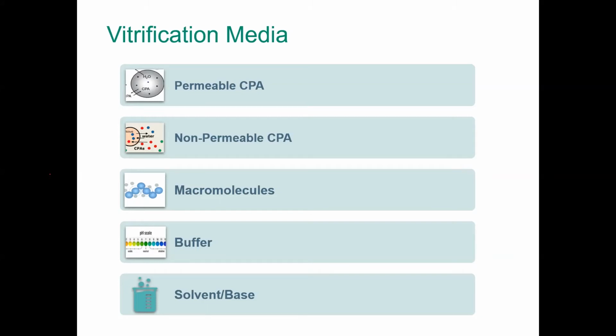So the media needs to be of high viscosity and to provide all that we mentioned about the permeable and non-permeable cryoprotectants, and using the macromolecules to actually help the theoretical principles of vitrification to be applied with any cells.